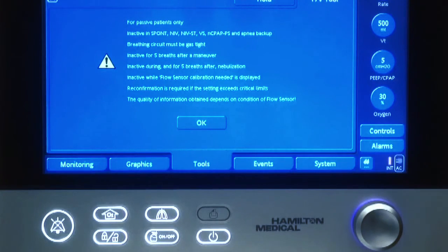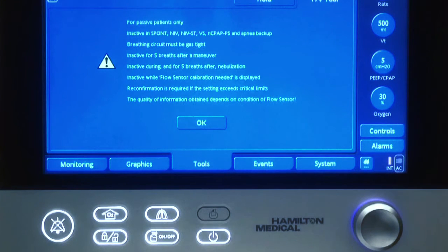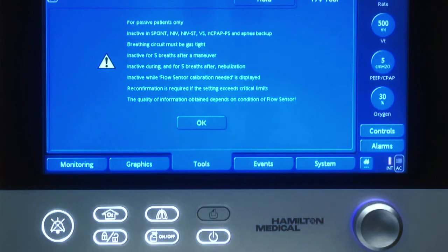Here the machine reminds you that you can generate a PV curve only under controlled modalities, and that the ventilation will be inactive for 5 breaths after the start of the maneuver.